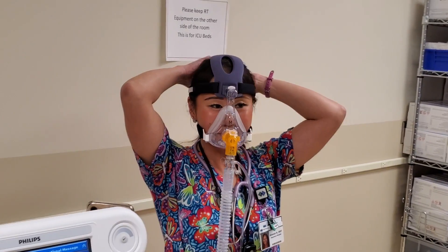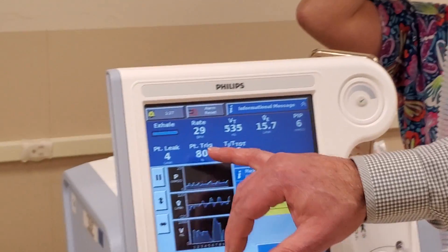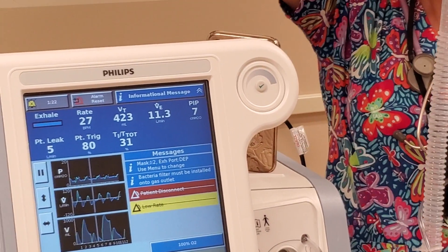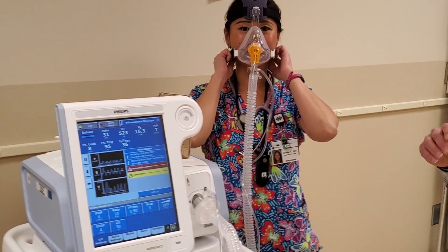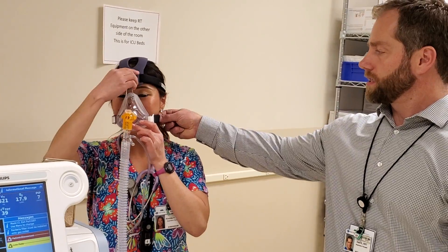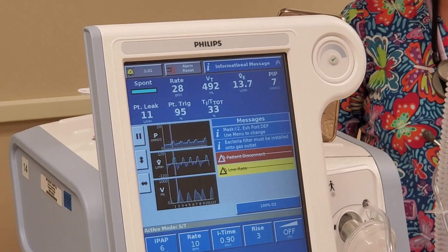Once it's on, we want to ensure that we've got a good leak. Currently this shows a leak of 4 or 2 — we want that to be between 10 and 60. Now we're showing 10 and 8. When it's too low, that indicates the mask may be too tight and we're at risk for a pressure injury. So what we can do is just loosen the mask up a little bit, and we're seeing a leak above 10 so we can feel pretty comfortable with that.